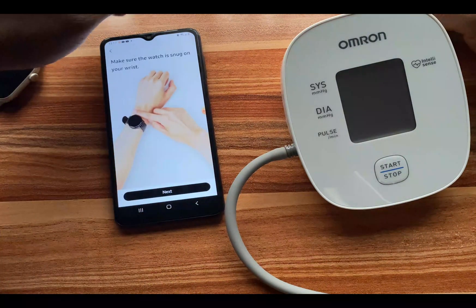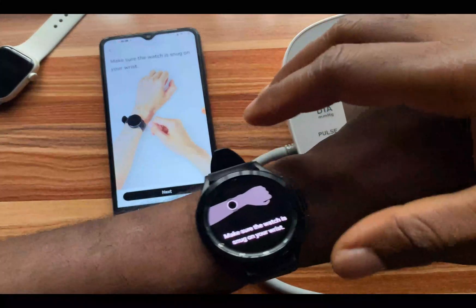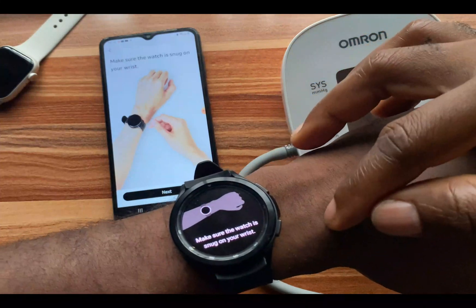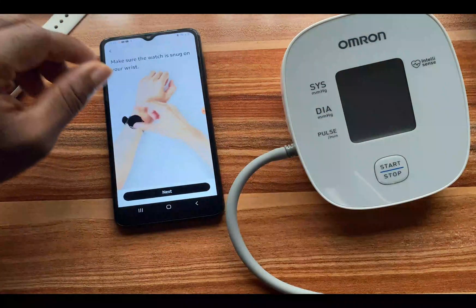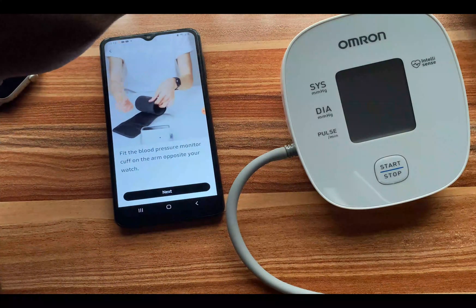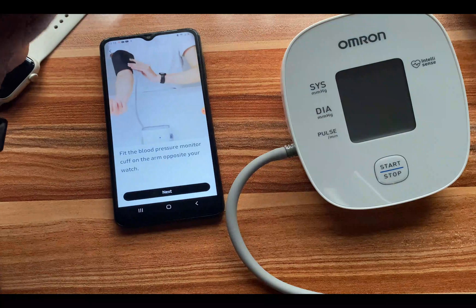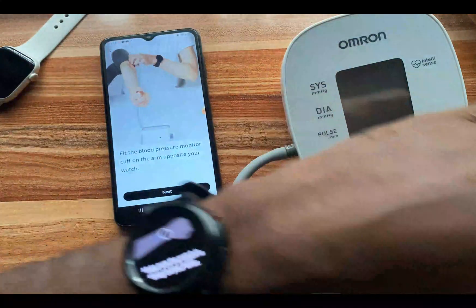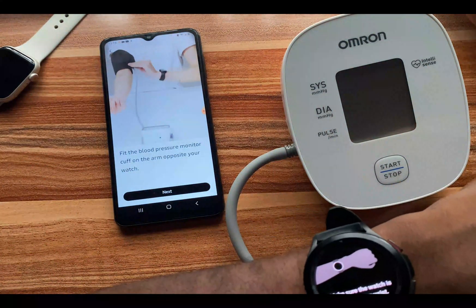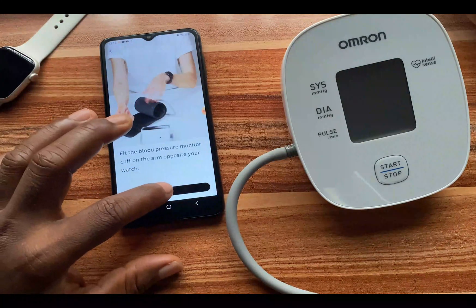After tapping 'Get Started,' it says make sure the watch is snug on your wrist — I have it snug with some distance between it and my ankle. I'll tap 'Next.' It says fit the blood pressure monitor cuff on the arm opposite your watch. I'm wearing the cuff on my right arm and the watch on my left wrist. I'll tap 'Next' to continue.